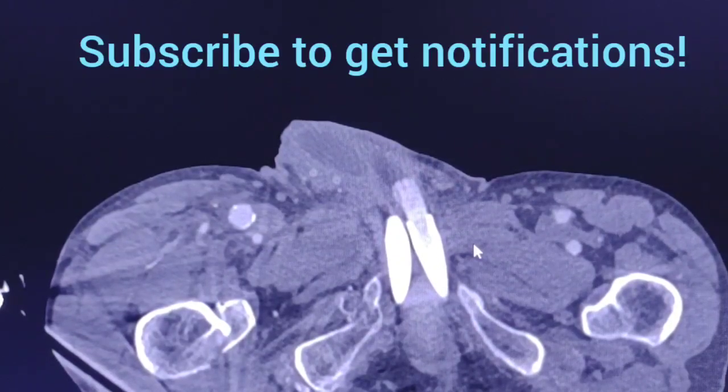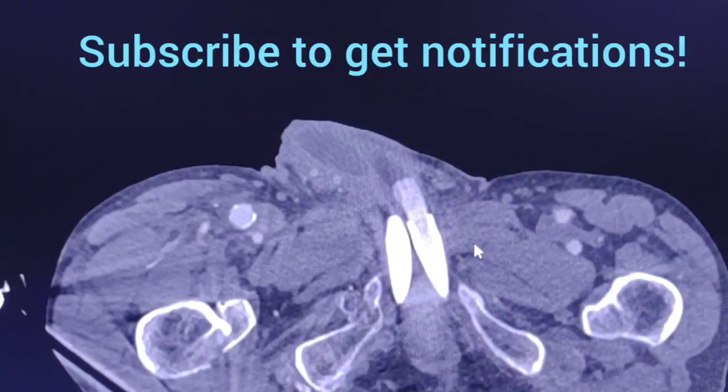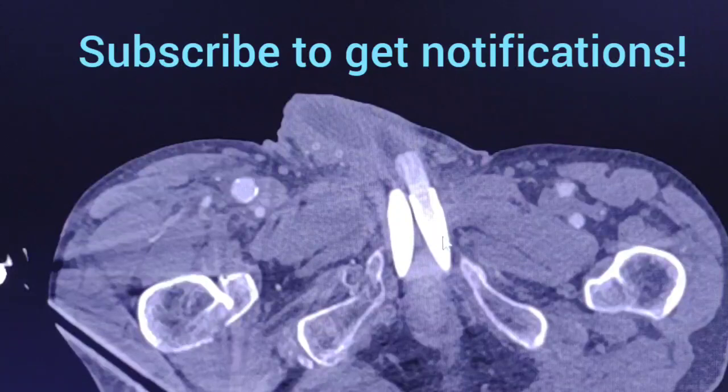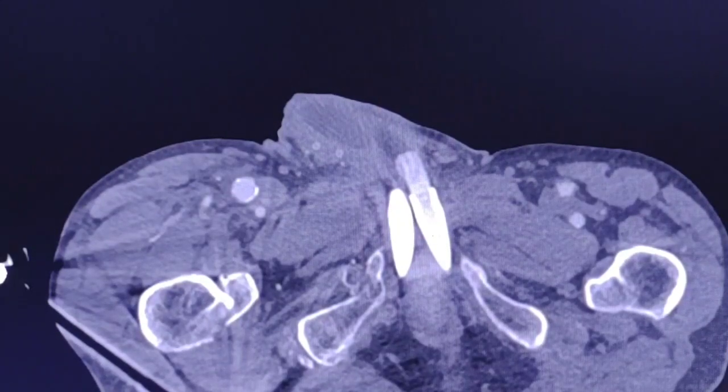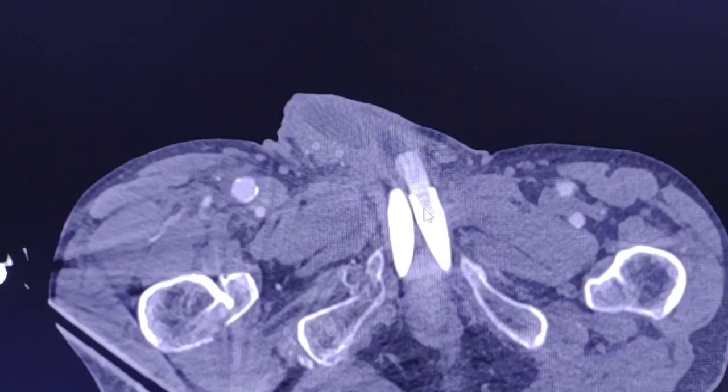In our case we have a three-piece hydraulic inflatable penile prosthesis and it consists of two cylinders. You can see here the two cylinders within the corpora cavernosa.